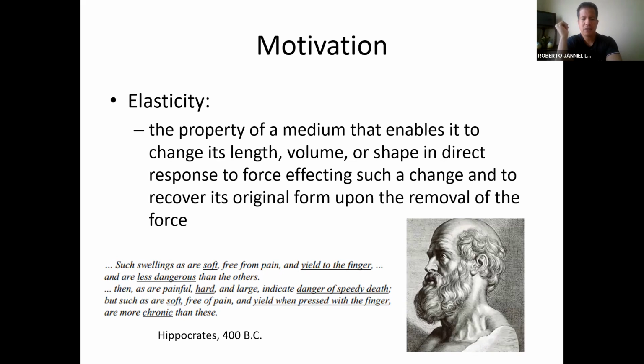The basic idea of elastography in general is related to the knowledge that typically when you have diseased tissues, they get to be stiffer than the normal tissues. And this is a broad assessment. Even when we talk about cancer, we typically assume that cancerous tumors are stiffer than their benign counterparts.